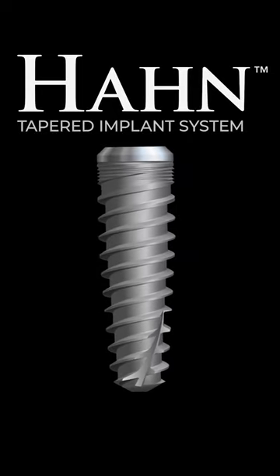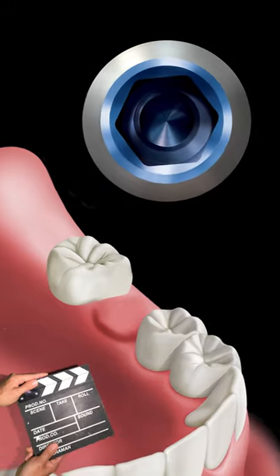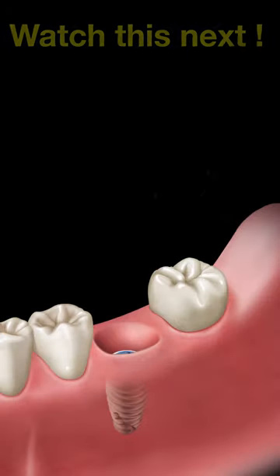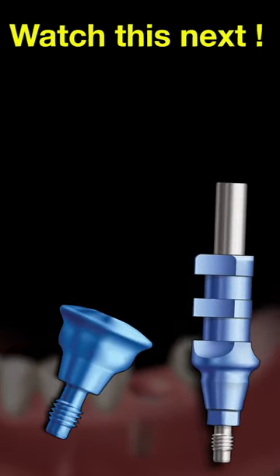On this patient, a Hahn tapered implant 5mm in diameter was placed at site number 19. The platform size and/or diameter of the implant placed is information you will need to order the subsequent restorative copings and abutments.